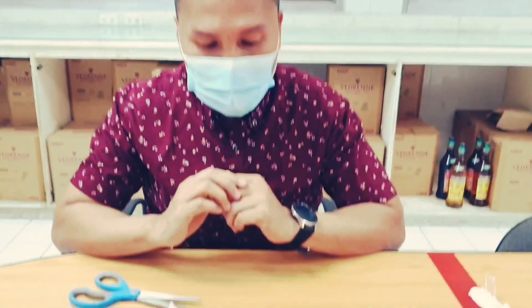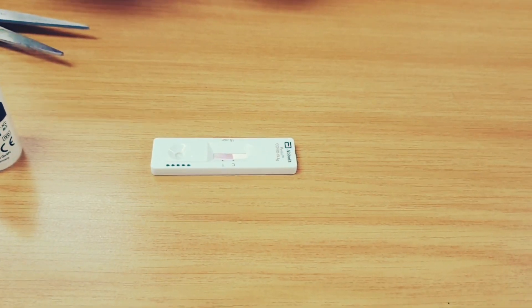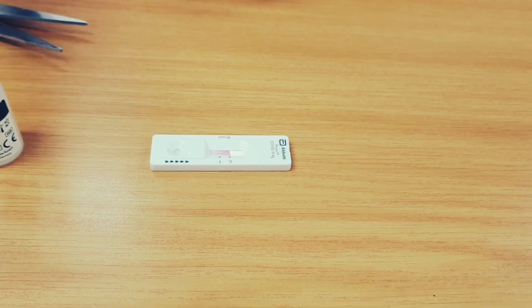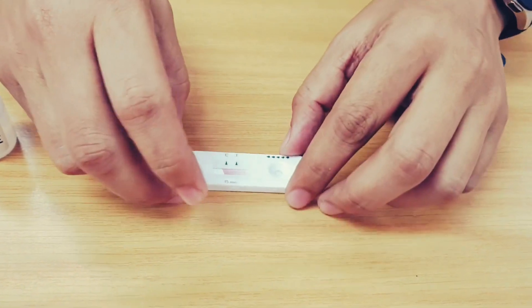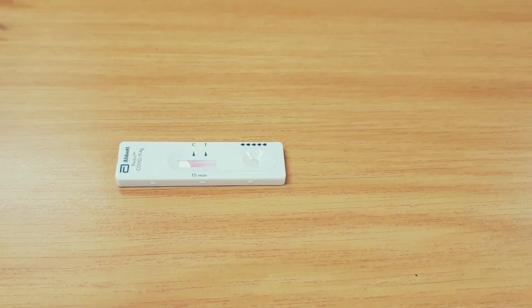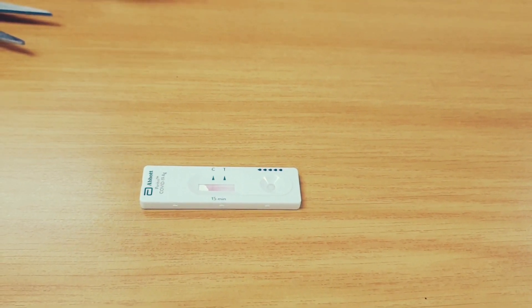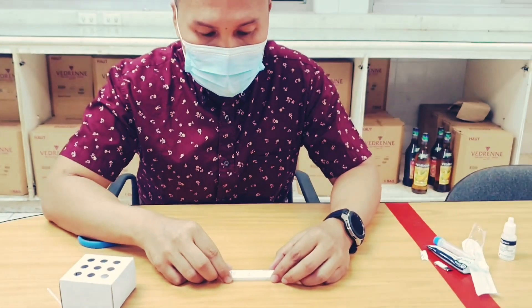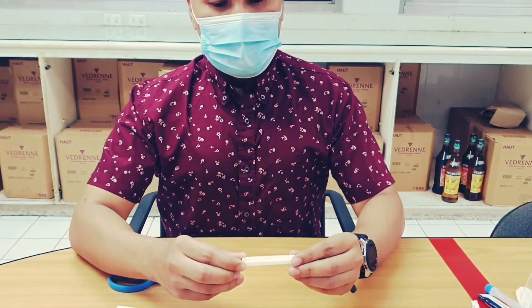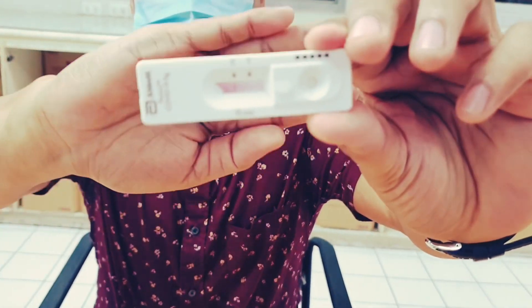If two lines appear, then you are COVID-19 positive. We wish to see just one line, which means that you are free from COVID-19. In my case, I only have one line.